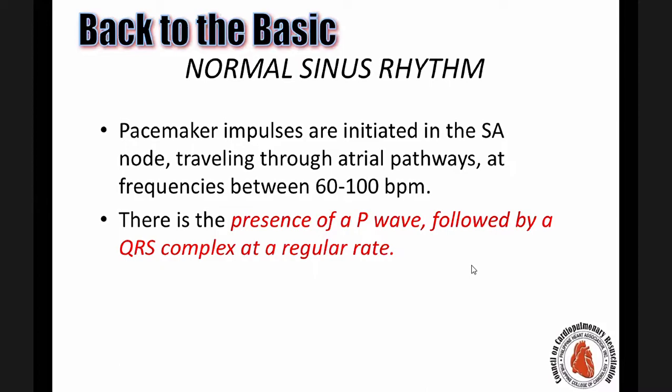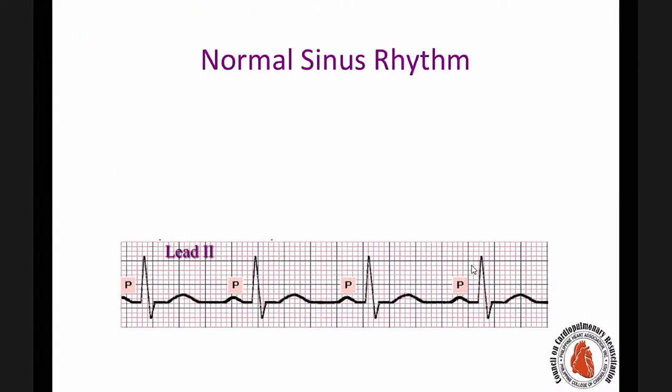So the sinus rhythm, to say that it's a normal rate, should be between 60 to 100. If it's more than 100, it means tachycardia or sinus tachycardia. If it's below 60, we call it sinus bradycardia. So for you to look at the ECG, you have to closely look at the P, and then it should be followed by a QRS complex, and then a T wave. That's a complete beat. And in every beat, all the important waves should be there, the PQRST.